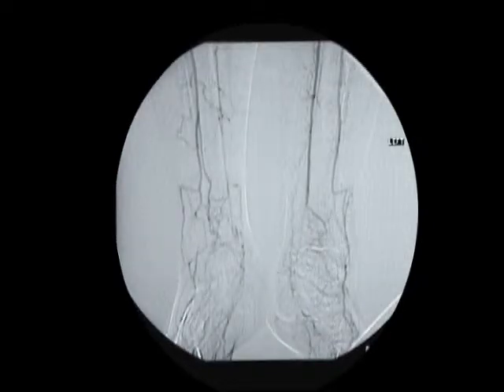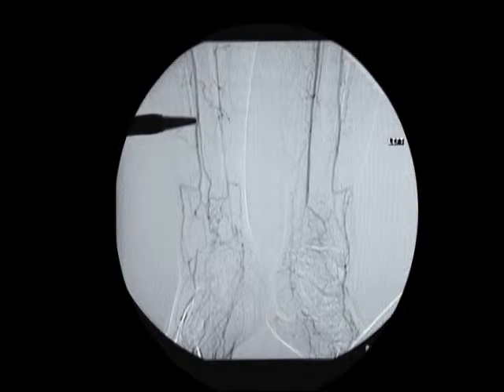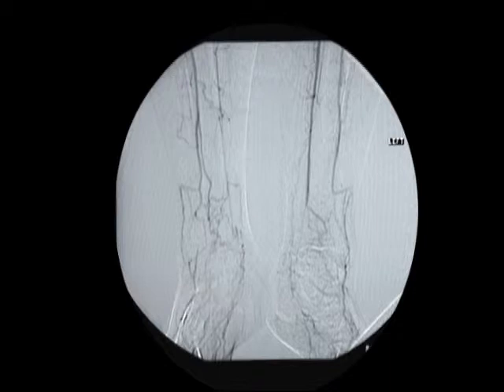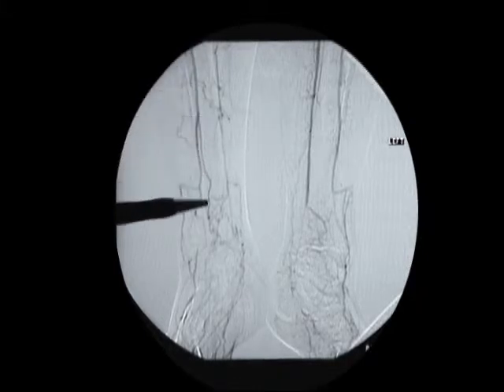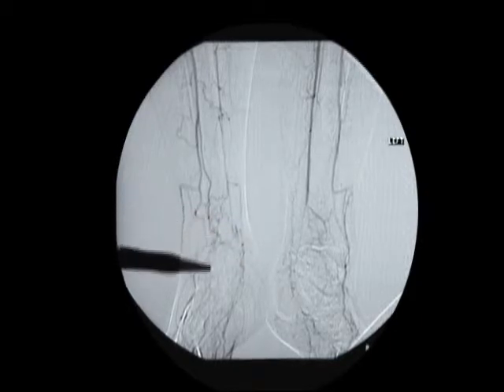Continuing the runoff on this patient, the posterior tibial artery is occluded. The peroneal, however, is a robust runoff vessel providing anterior and posterior collateral branches collateralizing into the foot. Unfortunately, the collaterals don't significantly cross the ankle, and this patient presented with forefoot ischemia. Therefore, in considering the injection protocol for this patient, since our inflow is quite good through the peroneal to the level of the ankle, concentration will be paid on distributing the bulk of the injectate across the foot.